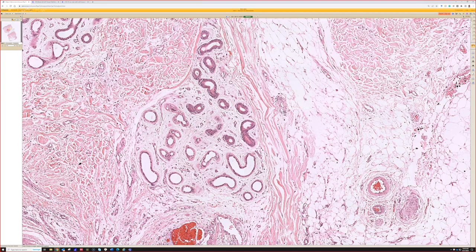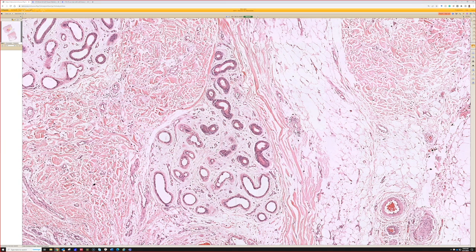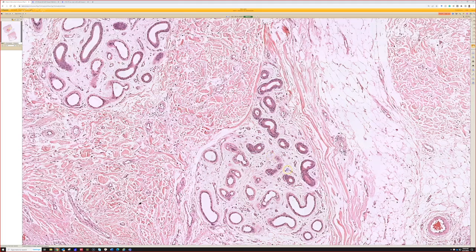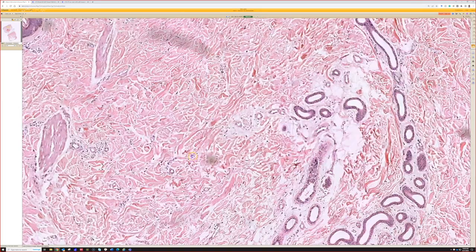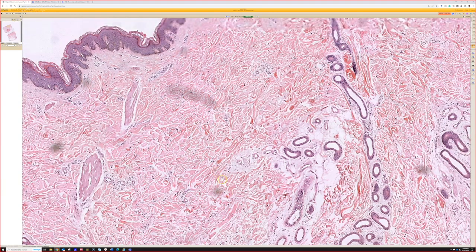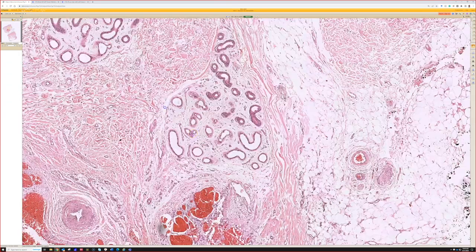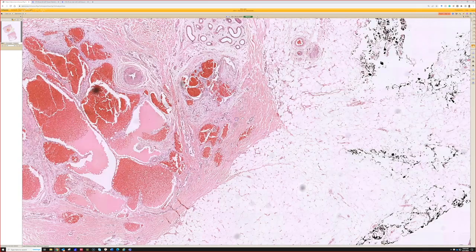I do not use that as evidence of connective tissue disease like lupus. I find that it is normal to have a variable amount of myxoid material around here, just like you see it in the lining of a nerve inside the perineurium. In those settings I totally ignore it, and I don't use that as a useful clue to diagnose lupus at all. I will only use having the right inflammatory pattern and also interstitial mucin — that's where I'm looking. So in my book, I just ignore any mucin around the eccrine coil as not being helpful as a point towards connective tissue disease.